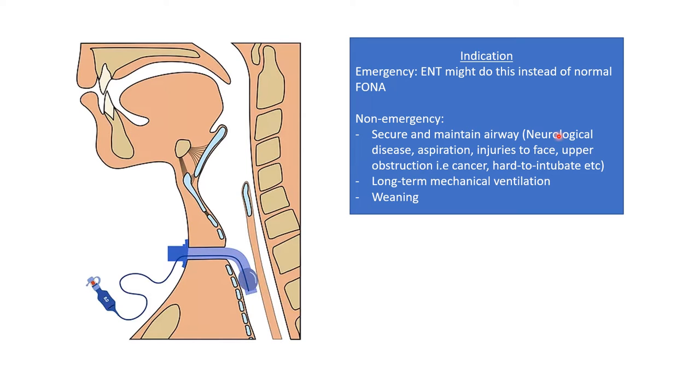This is usually if the patient has a neurological disease that is hindering this, or if they have a high risk of aspiration, if they are injured in the face, and so on and so forth. There are a lot of reasons why you want to do this. One of the more common reasons is also if they have a hard to intubate upper airway, then you can put in these in advance of a procedure.